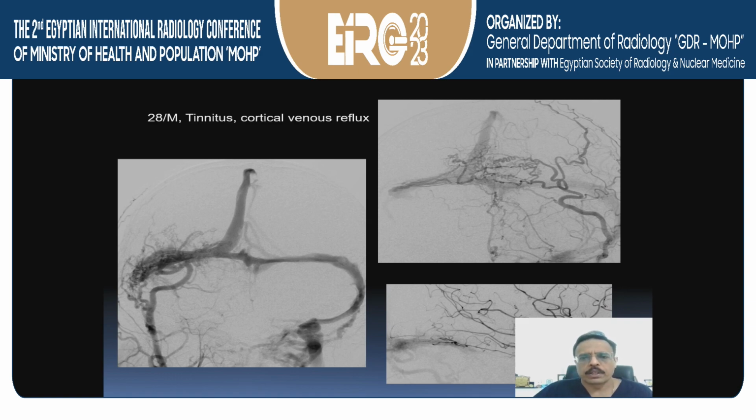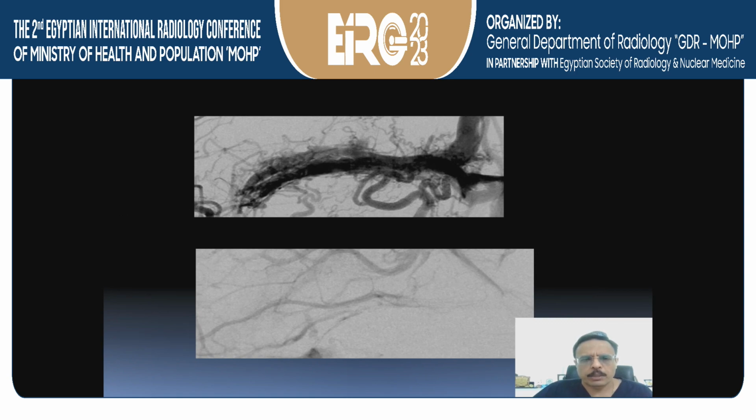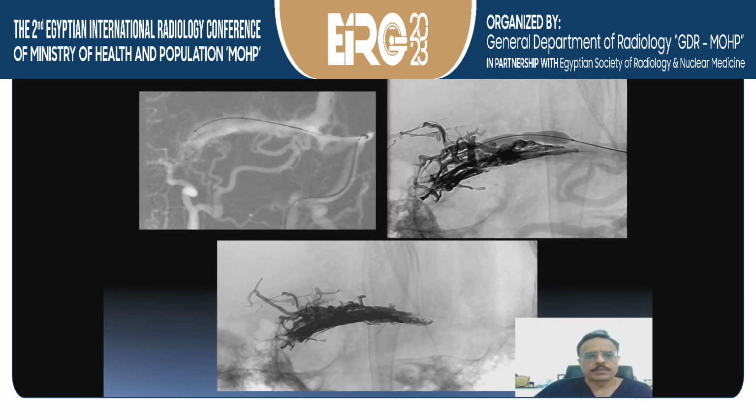Right lateral sinus dural AVF. You can see the multiple compartments there, but what you can see in the upper and lower image is that the big cortical vein of Labbé opens into the upper part of the sac. So you want to preserve that somehow. So we placed a balloon there so that the Onyx material doesn't go into the vein origin. We did transarterial embolization initially, and then transvenous embolization using the balloon from that lumen.